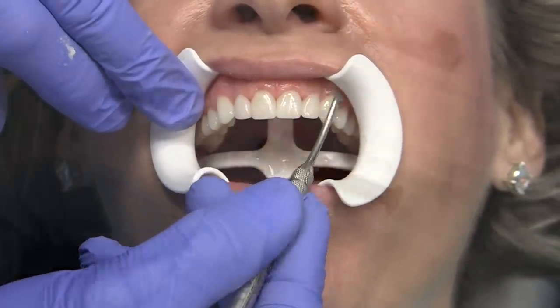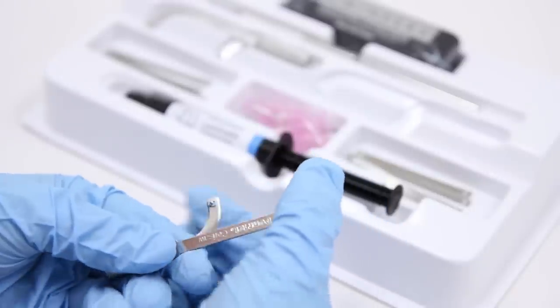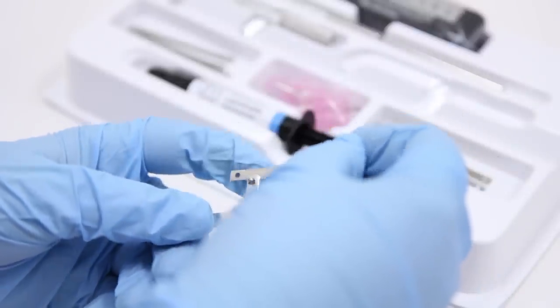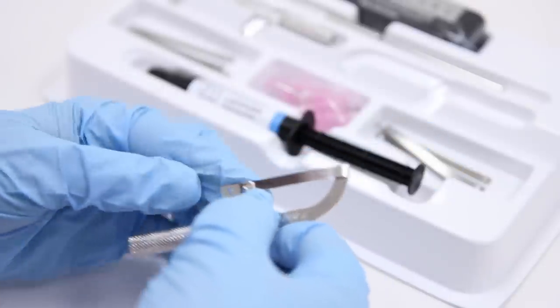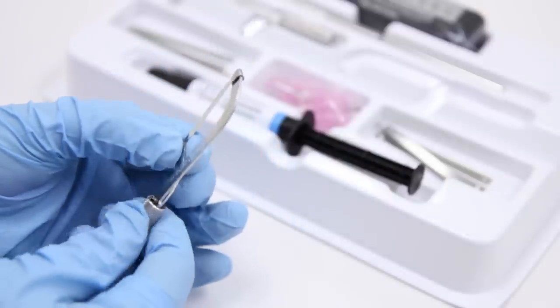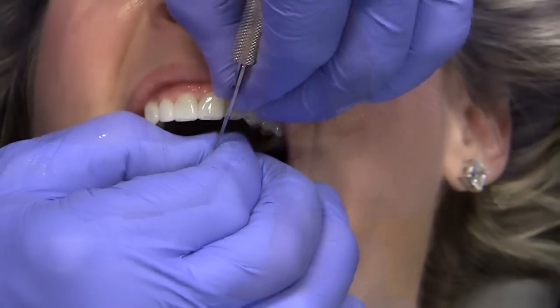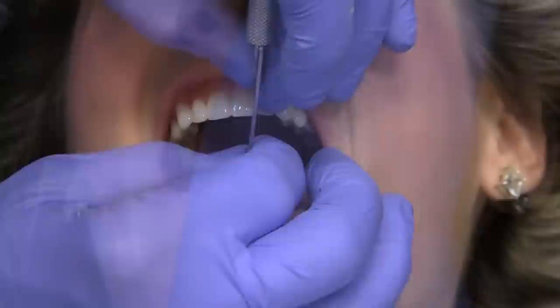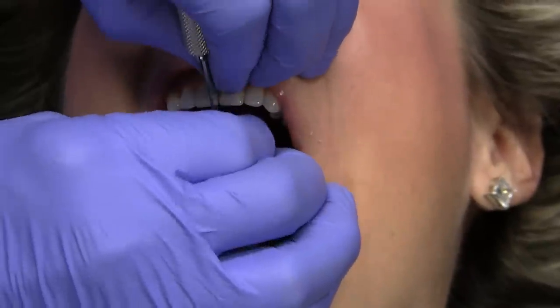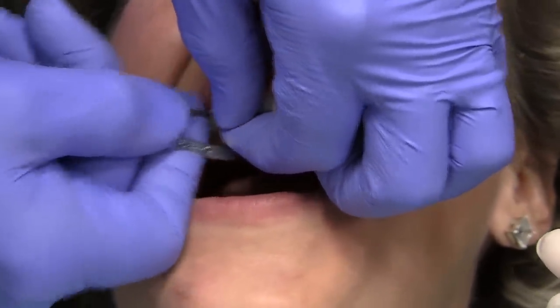To assemble the Seri Saw or Seri Sander, simply add a strip by loosening the handle grip and turning counter-clockwise. Drop the Seri Saw or Seri Sander strip onto the pin located at the front end of the handle, then back around the pin to the rear end of the handle. The strip forms an S-shape around the front and back handles. Turn the handle grip clockwise to tighten, which also tightens the pins and strip. Use the Seri Saw to separate the teeth using a rocking motion. Use the fine grit Seri Sander to smooth the interproximal surfaces, then the ultra-fine grit Seri Sander to further smooth them. Use each sanding blade only two or three times per tooth to smooth the contacts.